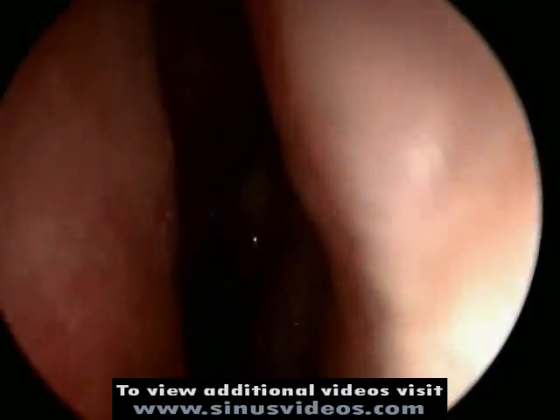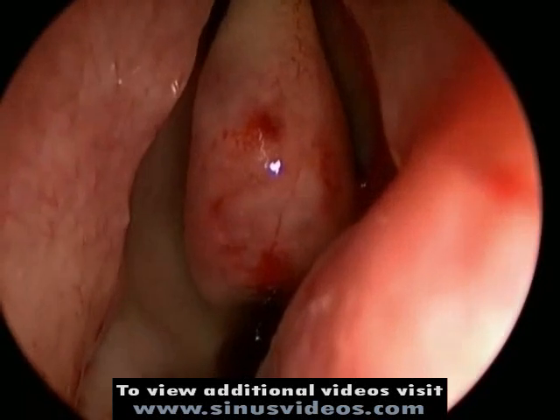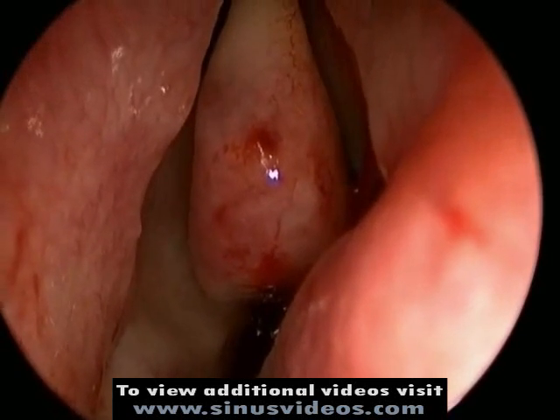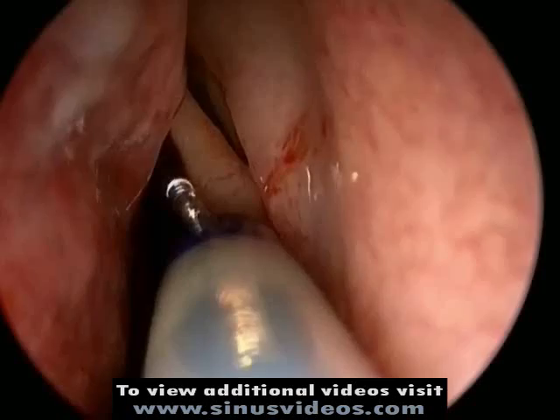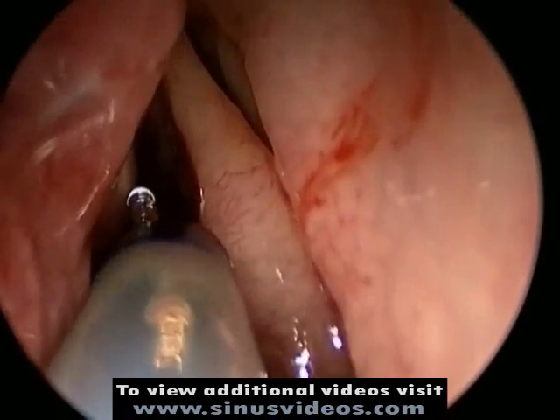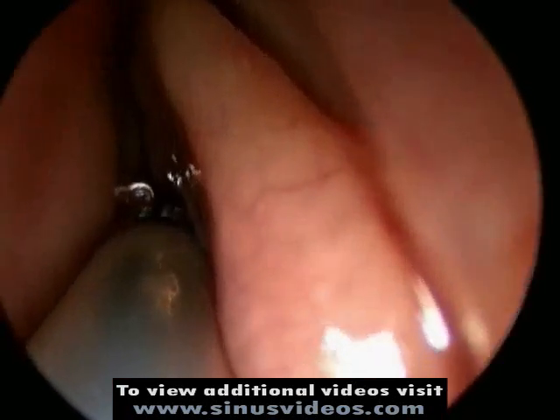Balloon dilatation of the sphenoid sinus begins with passage of a guide catheter — in this case a zero degree catheter — with a guide wire with an illuminated tip passed through the center of the catheter.